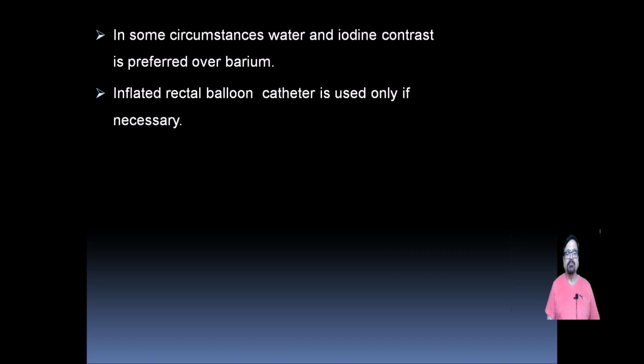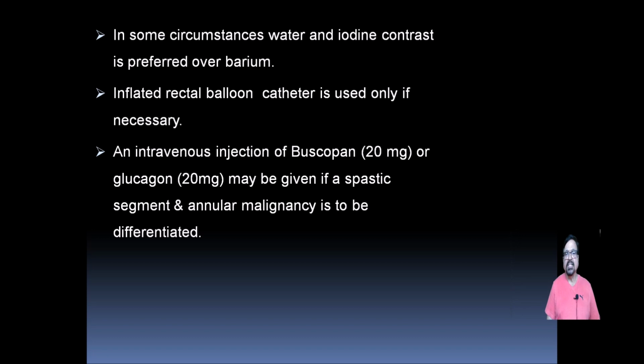Then an inflated rectal balloon catheter is used only if necessary, because there is a high or added risk of perforation, and this is usually used in debilitated patients or in the elderly who cannot hold barium.